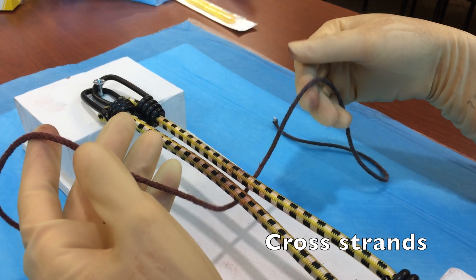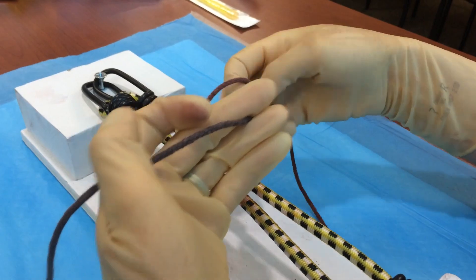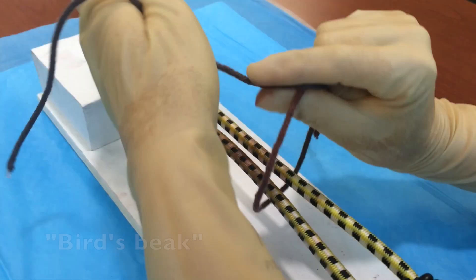Your first step is going to be to cross your strands. Notice your dominant right hand takes the strand that's farther away from you. Next you're going to form what's called the bird's beak using your thumb and your forefinger. We're going to refer to this position again and again in our tying.